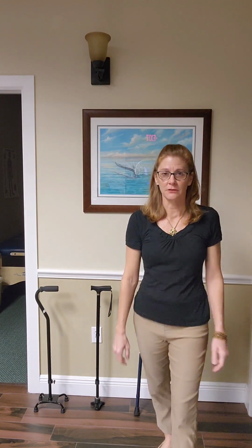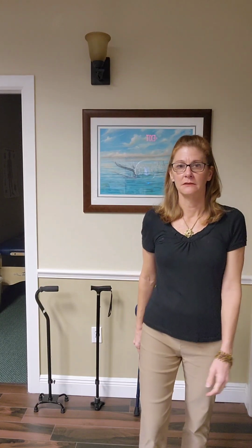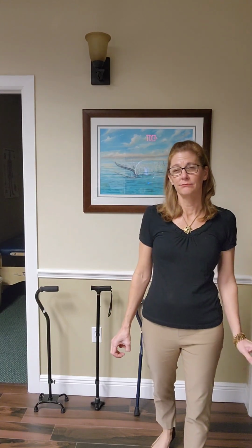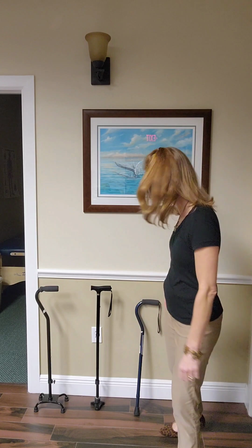So, how to use a cane, no matter which one you choose to use. What's really cool about how our maker put us together is that arm swing is natural. When we walk slowly, we won't have much arm swing. When we walk quickly, we'll really see a more exaggerated arm swing because our pelvis is moving and we're getting trunk rotation. It's not because we're forcing our arms, it's a side effect of this pelvic motion and the trunk rotation. So I say that because you really shouldn't, most of the time, have to think real hard about how to use a cane.